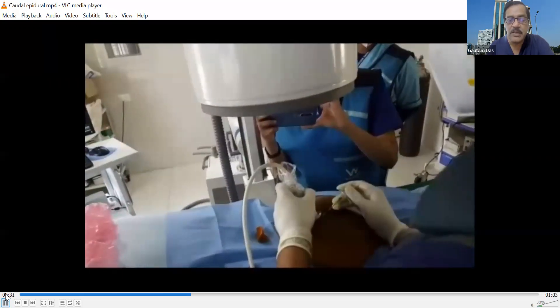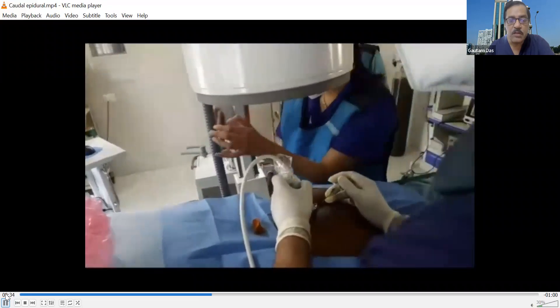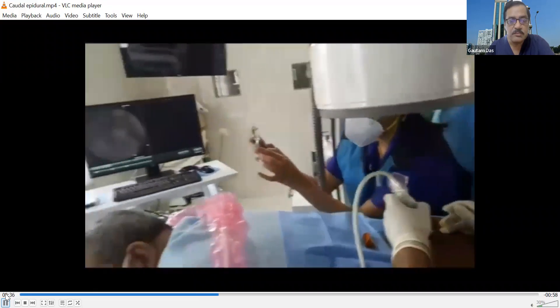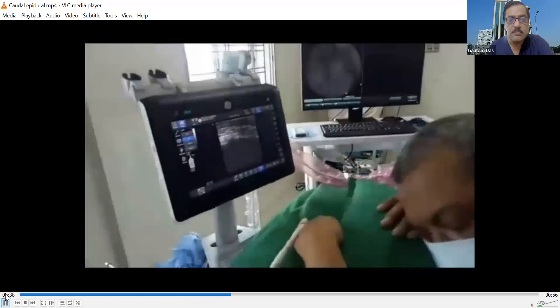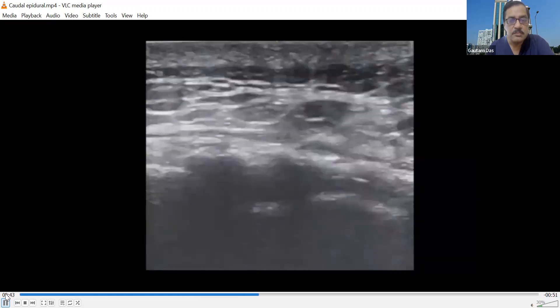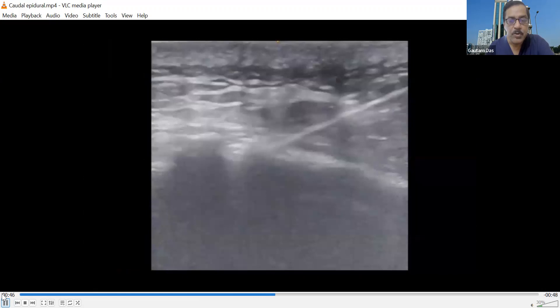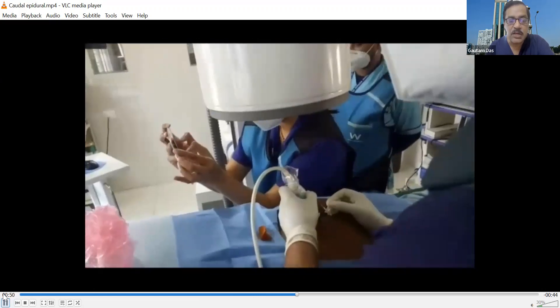Then, an 18-gauge spinal needle is introduced under ultrasound guidance. This is again the midline sacral crest, this is the sacral vertebral body, and this is the needle. The needle has been introduced; the tip of the needle is not seen because it is under bone.